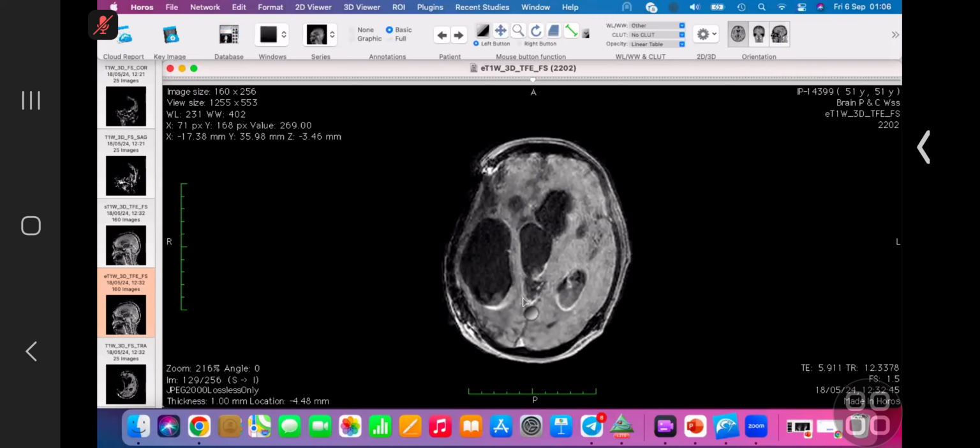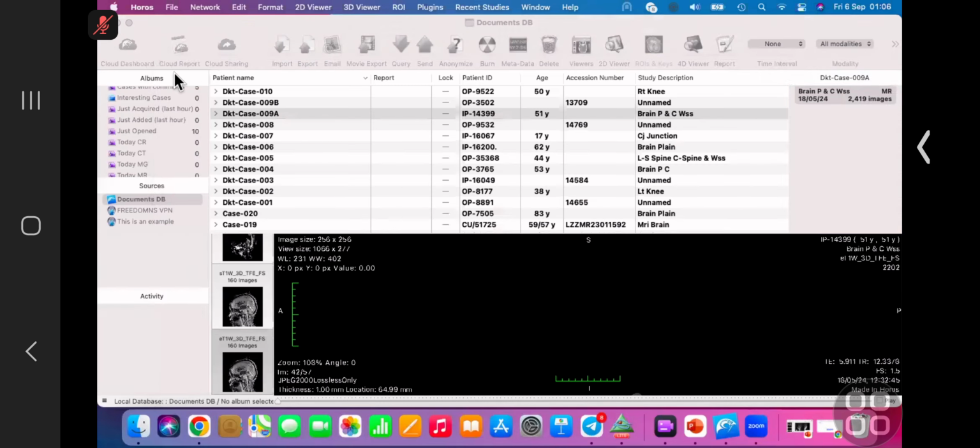So the neurosurgeon rapidly decompressed this, the patient was put on antibiotics, and then they repositioned the peritoneal tip of the shunt. The patient recovered well. I think she's here to come for follow-up for the next scan. Okay, so I'll show you another case. Case number 8.